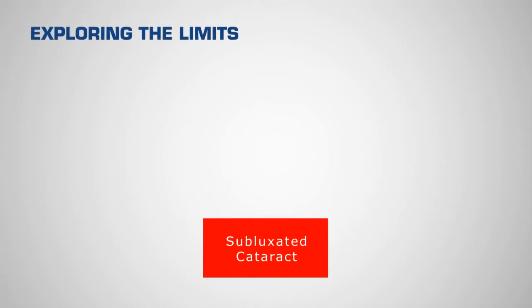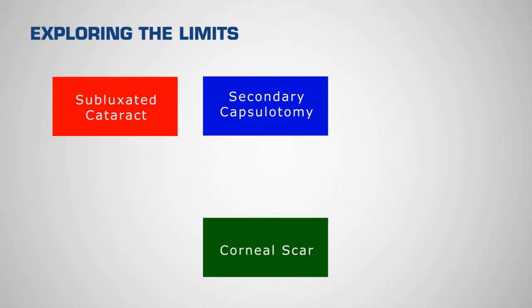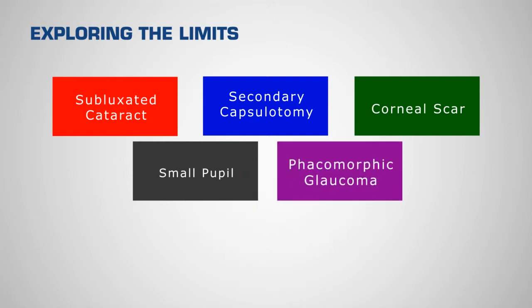We review exploring the limits of femtosecond cataract surgery in a patient with a subluxated traumatic cataract, performing a secondary capsulotomy in an aphakic eye, performing femtosecond cataract surgery in a patient with a corneal scar, a small pupil, and phacomorphic glaucoma.